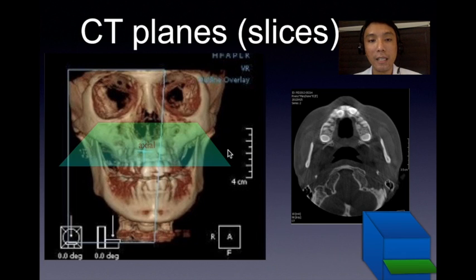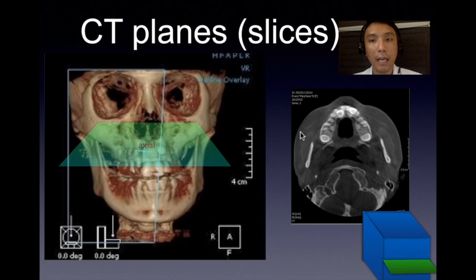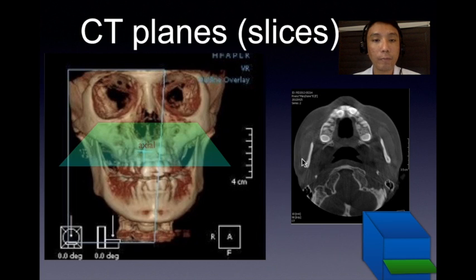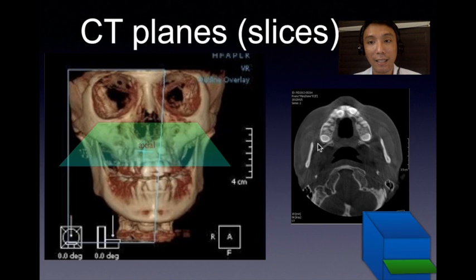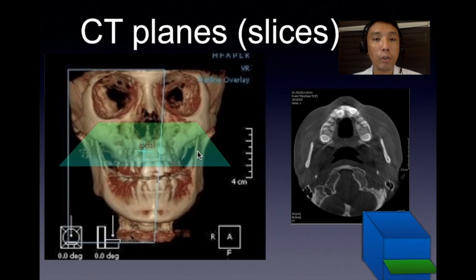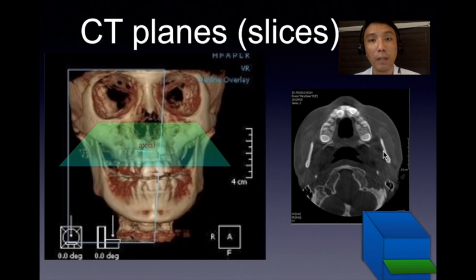From there, I could see certain structures — it has been cut here, so I see this cut section of the maxilla. I see the borders of the tip of the nose going down to the cheek, going all the way back to where the detector could still see it. I have in this particular slice a portion of the mandible, particularly a portion of the ramus, cut at a level where the mandibular foramen is.